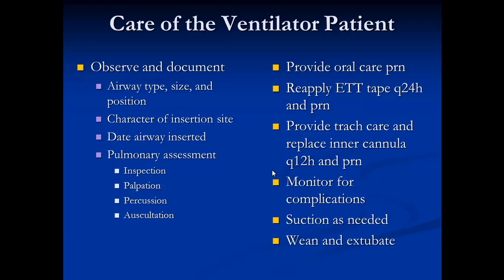The initial FiO2 should be 100% on all the patients. So unless you know the patient, if you know that this patient is a chronic COPD patient and you had the patient already on the floor and he was oxygenating properly on 40%, it's at your discretion to start mechanical ventilation at 40% if the patient gets in distress. But the rule is every patient that requires mechanical ventilation, the FiO2 should be 100% to start, and then you adjust based on ABG.